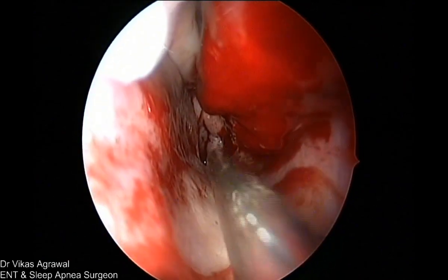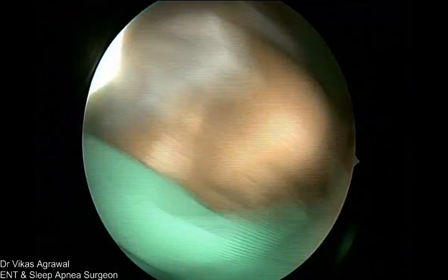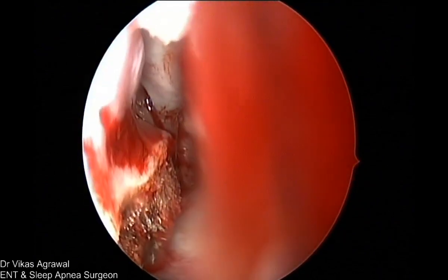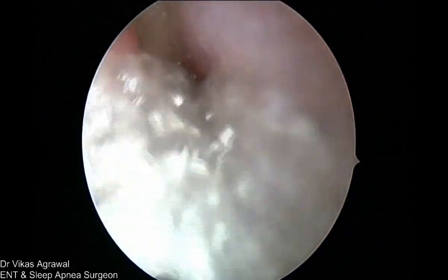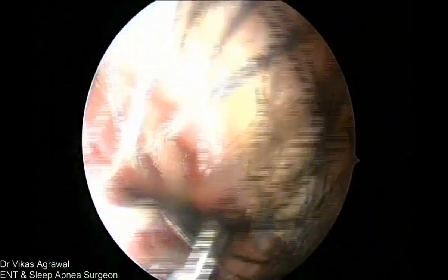Okay, so there is no big ooze. There is just a little trickle, a little ooze from the surface, which will stop by this. Okay, so what we'll do is we'll put this pack inside along the floor. Now see how slimy this is. It just walks in. This is carboxymethyl cellulose, so it will just walk in without any resistance, and the same way it will come out also while pulling it out.